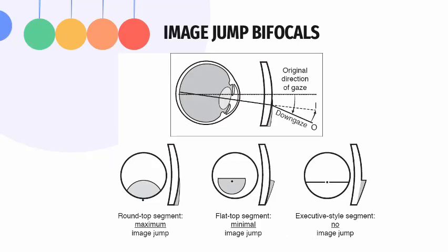Image jump in bifocal lenses was found to be maximum for the round segment bifocal, and the effect is quite minimum for the flat top segment bifocal. Interestingly, there is no image jump effect for the executive segment bifocal.